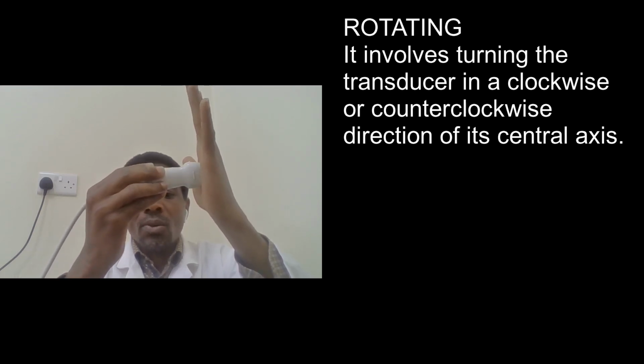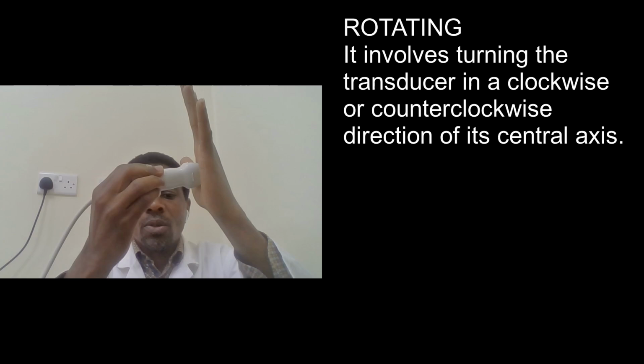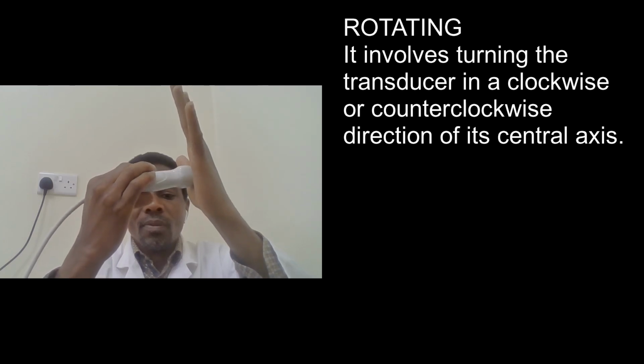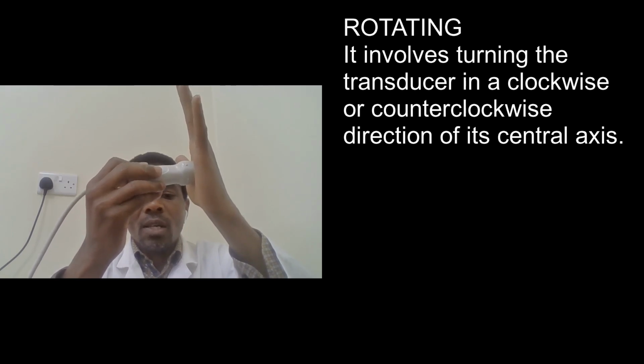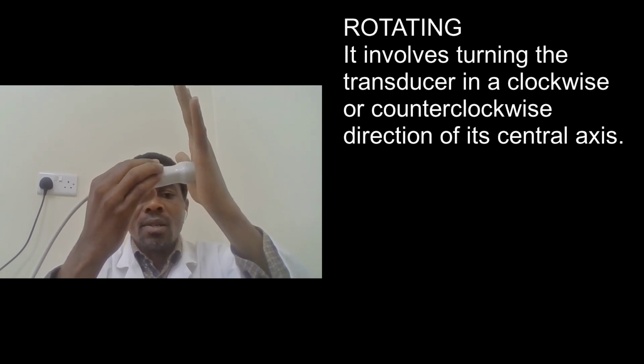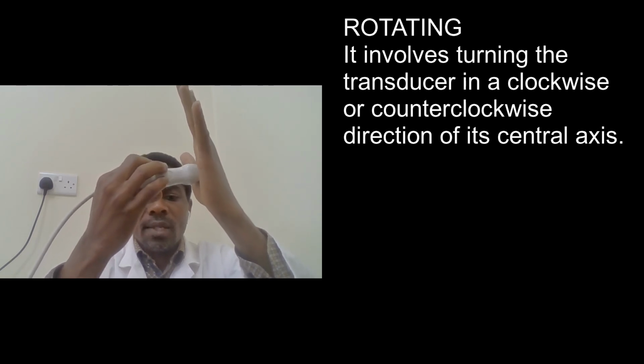Okay. So this is rotation. We are moving the transducer along its central axis, clockwise or counterclockwise.